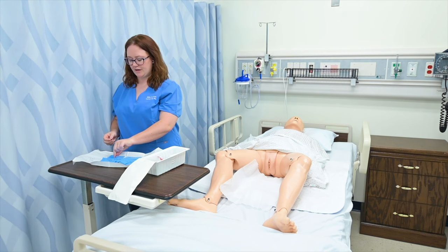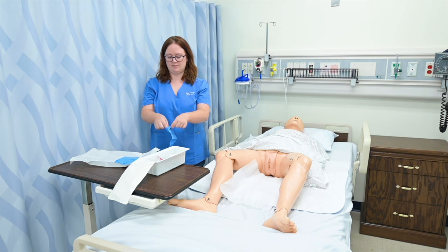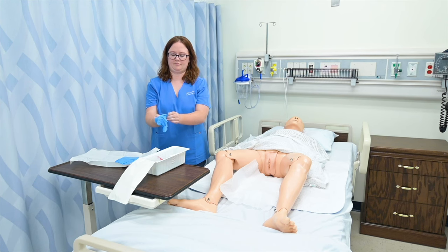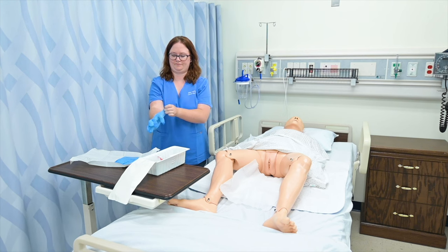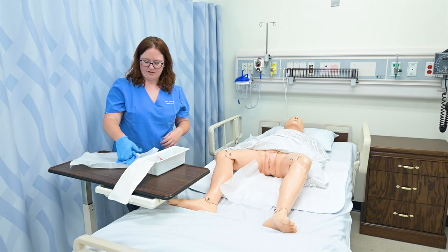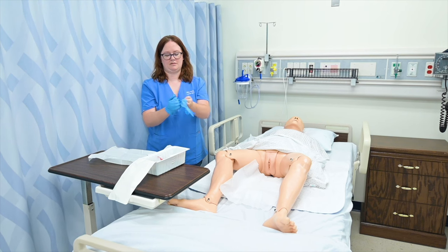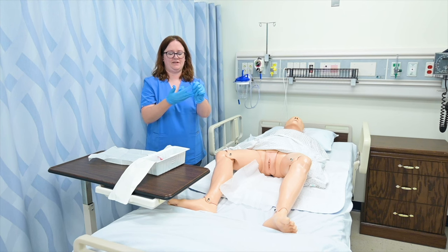All right, so I'm just gonna get my dominant hand's cuff with my non-dominant hand. And then my other cuff with my dominant hand. Fix these fingers, they got a little wonky.